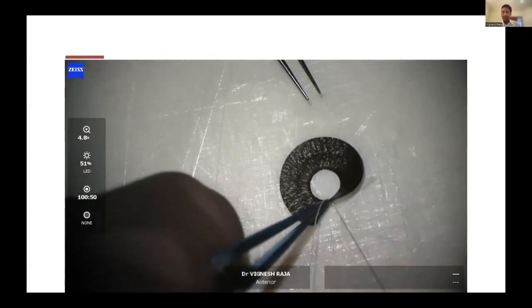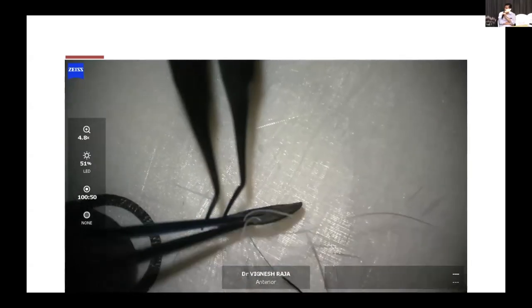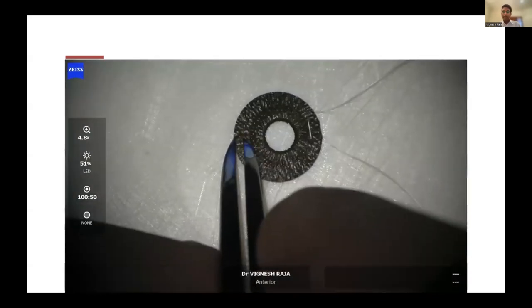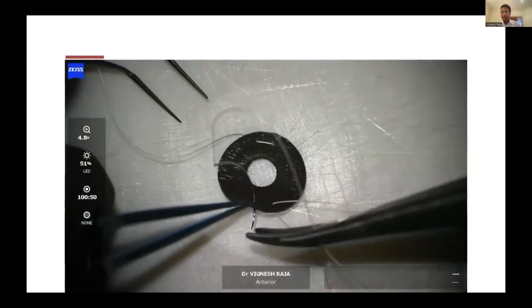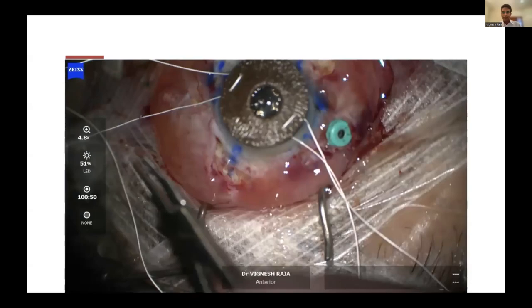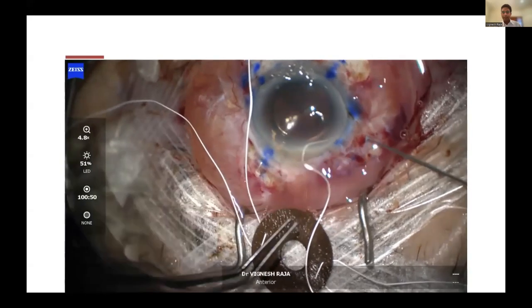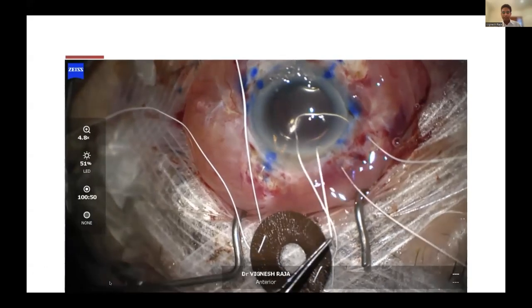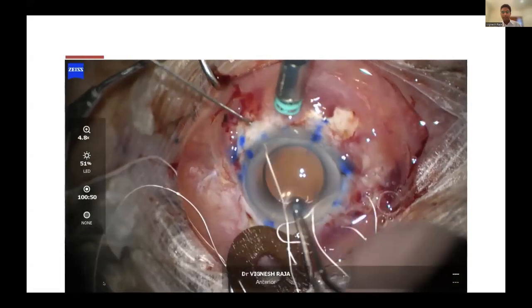So now I'm passing the CV8 Gore-Tex suture. This is a 7-0 Gore-Tex. You have to make sure that you're at least 1 millimeter from the edge, because you don't want the suture at the edge. And I use the boundary of the pupil as a guide. Likewise, I do the same from the other side. Again, it's all a 25 gauge max grip.